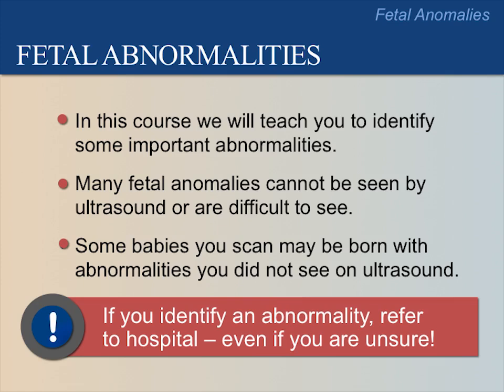If you identify a fetal abnormality, always refer to the hospital, even if you are unsure. It is more important to make the right referral than the right diagnosis.